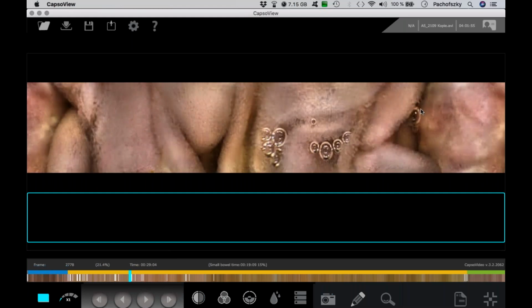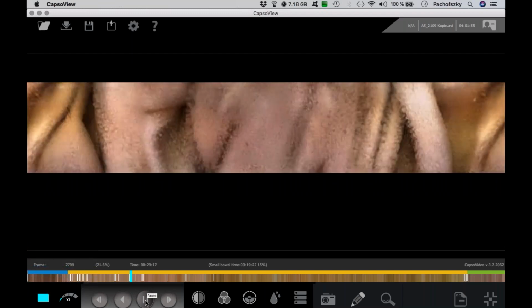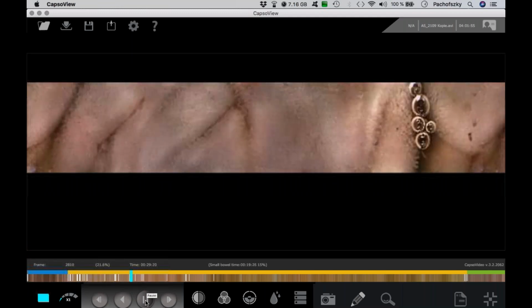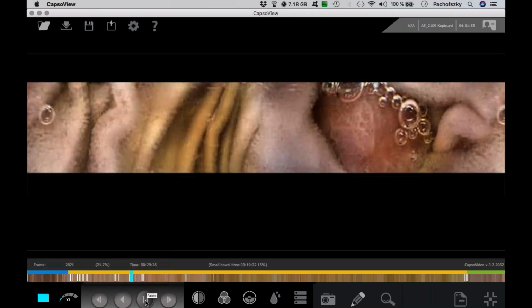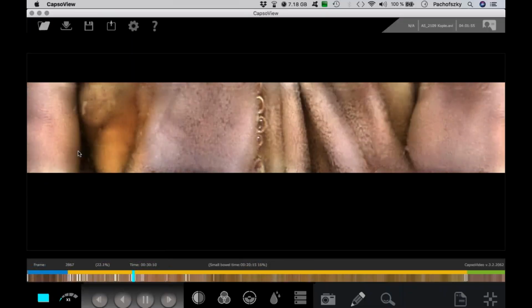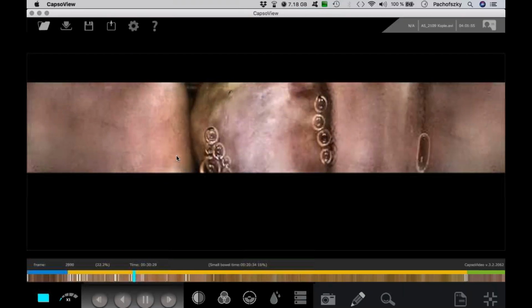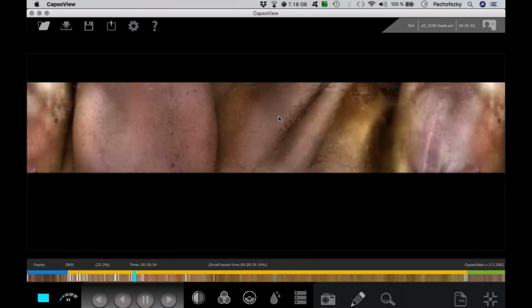Here it looks like an ulceration in this area, also again on the left side. And we're going down a little bit. Here you can see another lesion on the lesion in this area now. This is all a kind of ulceration and fibrinoid mucus on this lesion.